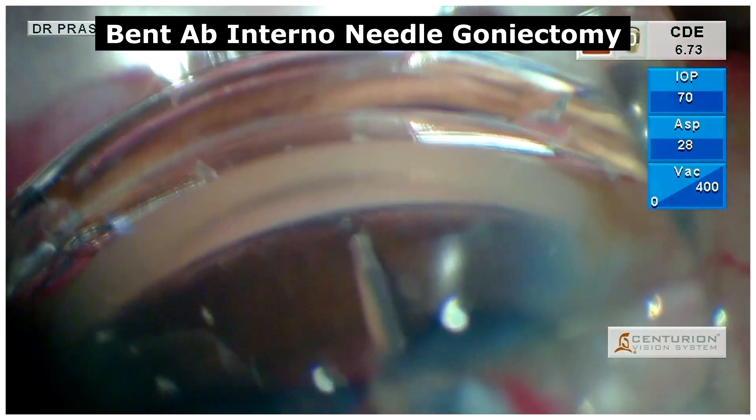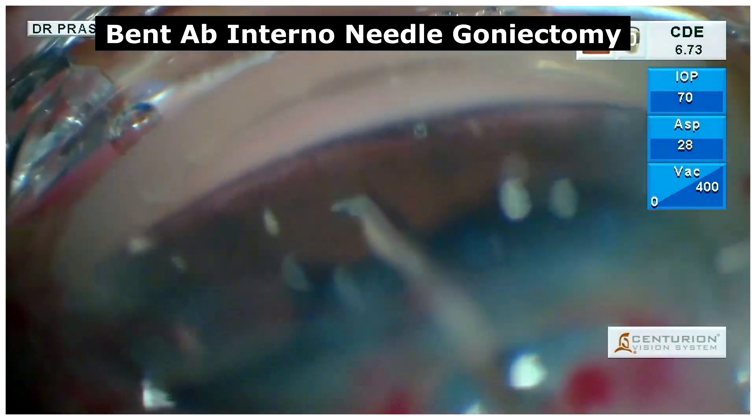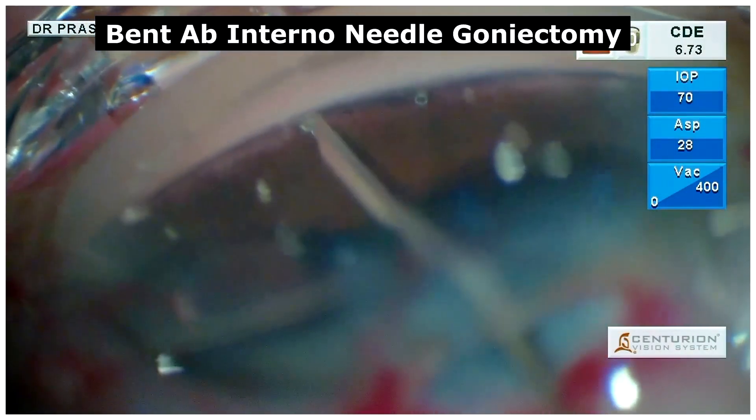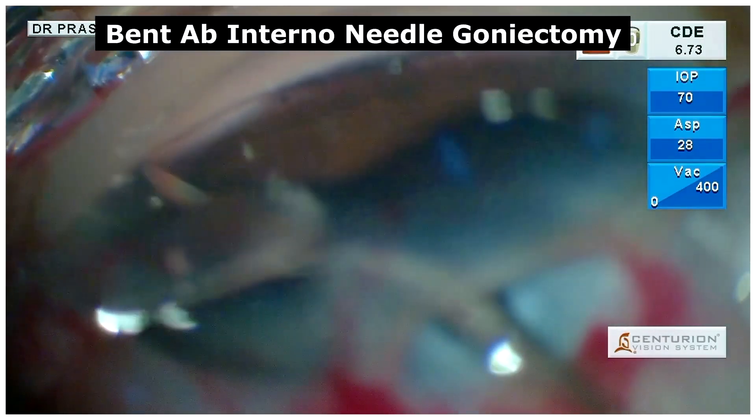Here, we did a bent ab interno needle goniectomy on either side of the implant at least one clock hour apart, to ensure an additional outflow via the trabecular meshwork.